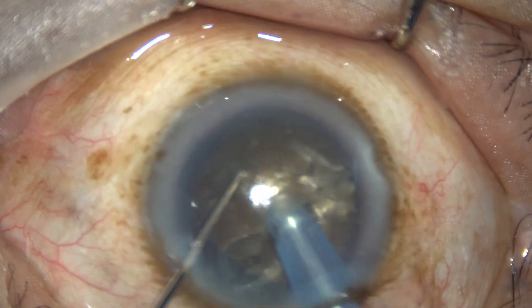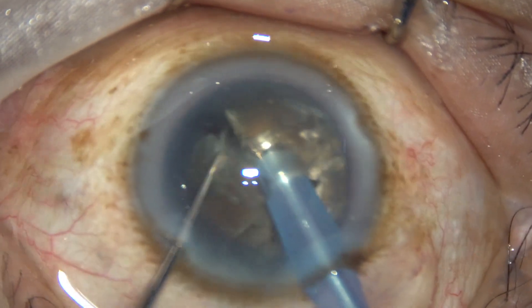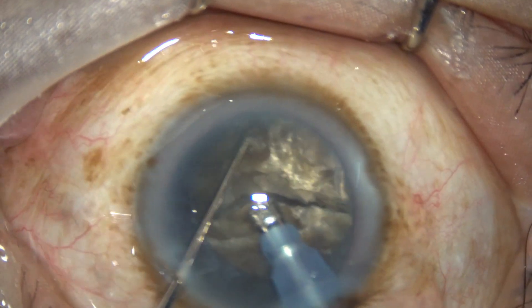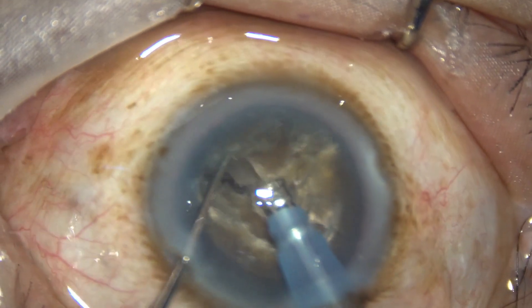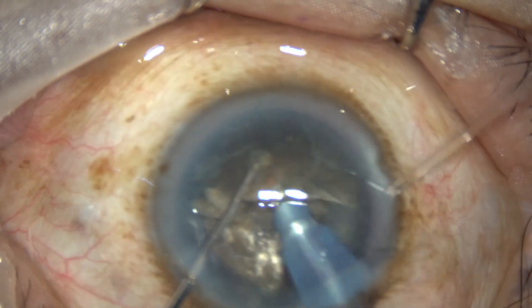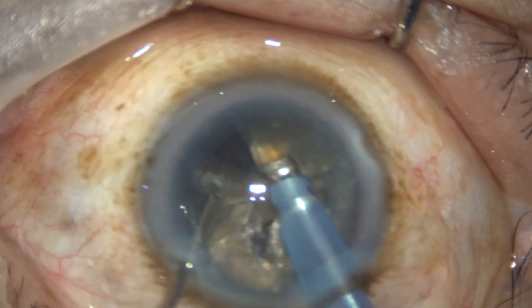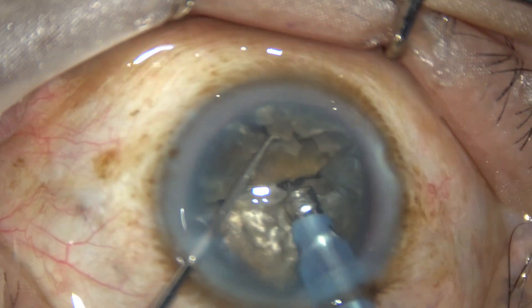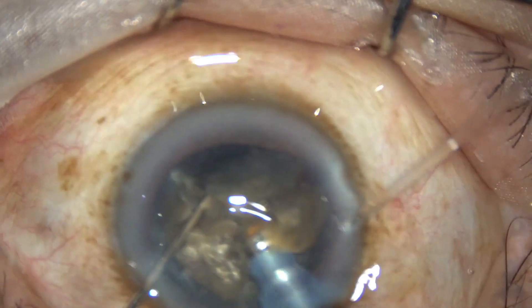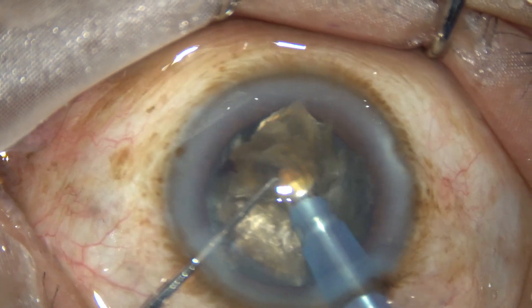We get two completely separate hemi-nuclei. Each hemi-nucleus is then subdivided into fragments. One hemi-nucleus has been divided into two large fragments. Now we rotate the lens mass, come to the other hemi-nucleus, go through the substance of the hemi-nucleus, and divide it into two pieces. The two pieces are joined at the central area, and a small burst of ultrasonic energy separates them.